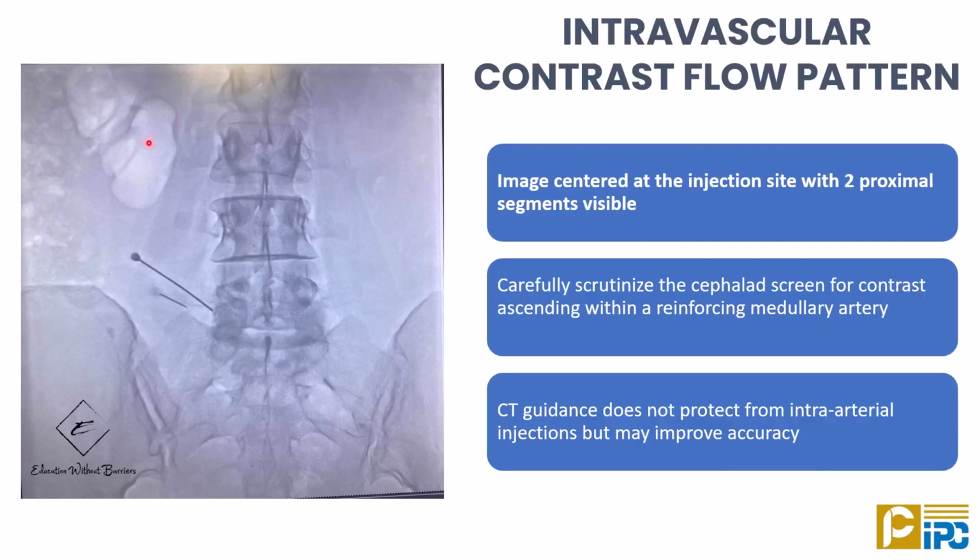So when you're taking the image to look at the contrast, you should have more of the proximal segments visible, because any flow from the arteries is going to be carried in that direction, and you should be able to scrutinize the cephalad spread and pick it up.